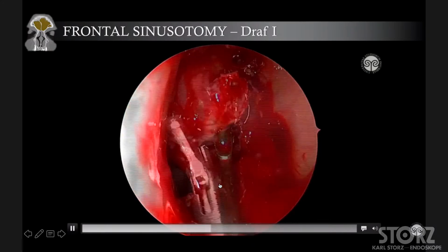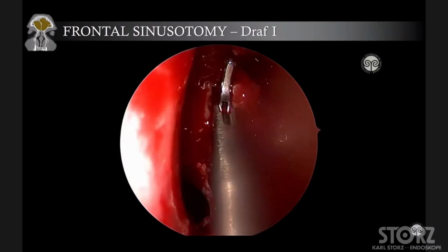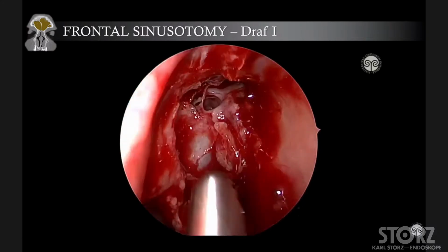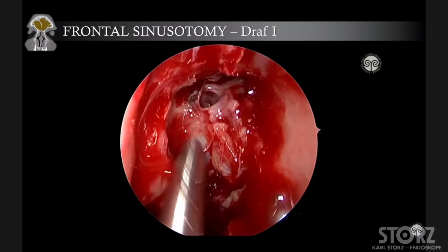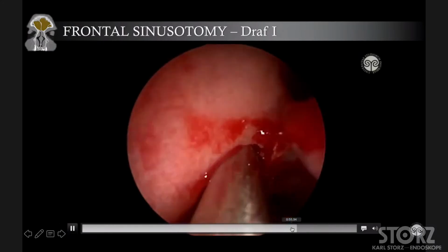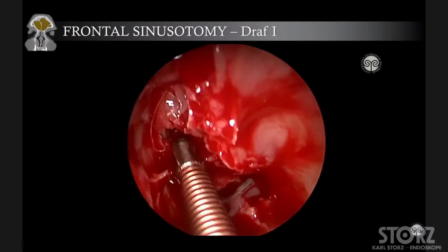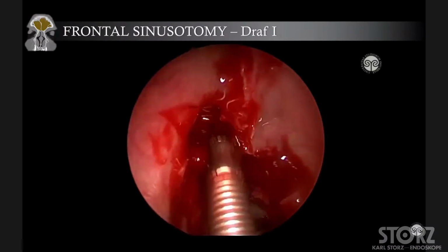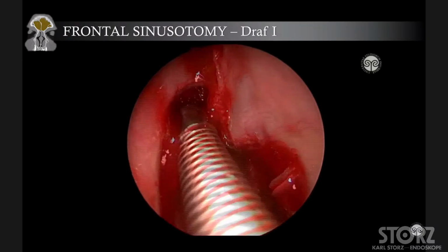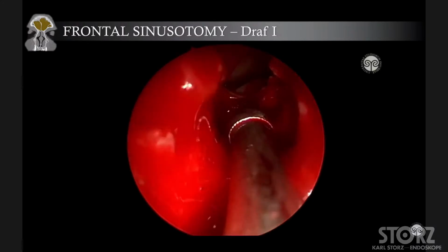We are opening the bulla now on the right side. We are cleaning all the anterior ethmoid. And once the anterior ethmoid has been cleaned, we can identify the frontal sinus. You can see, we are cleaning now the frontal recess. We have removed and opened the agger nasi cell. And once the agger nasi cell has been opened anteriorly, we can expose the frontal sinus in this way. You see the frontal sinus on the right side that is fully exposed.